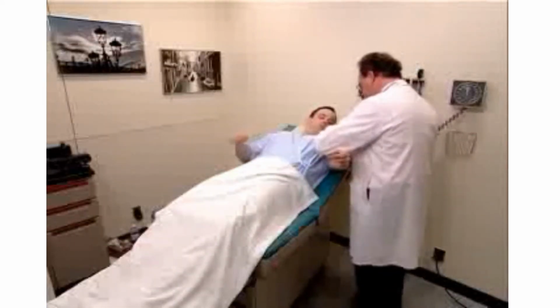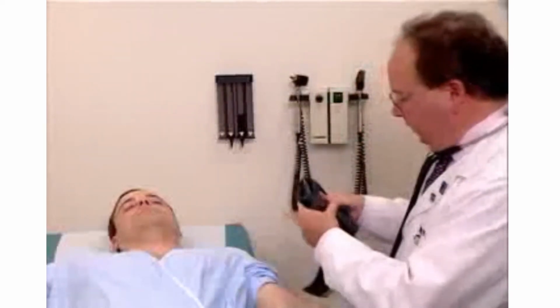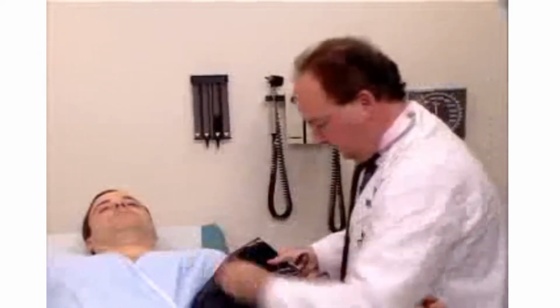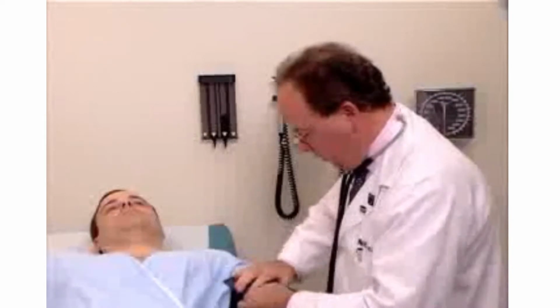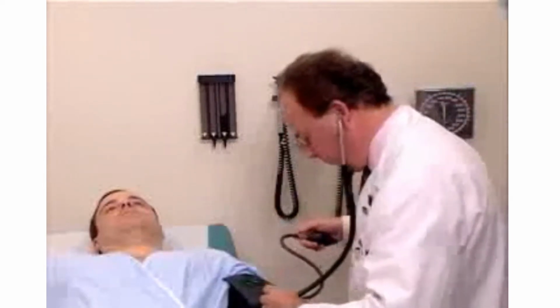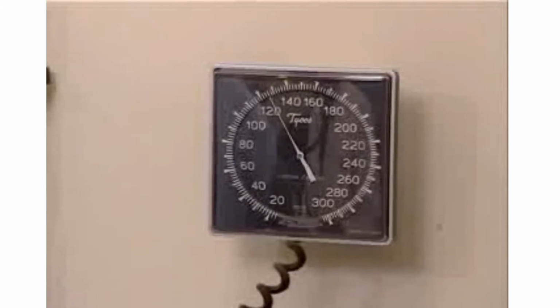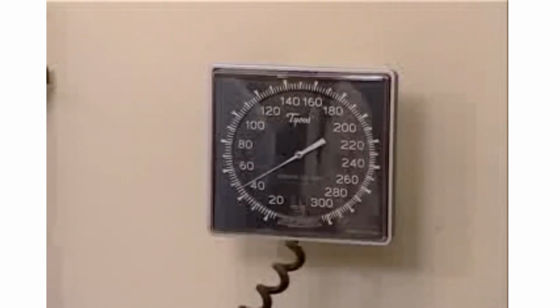Mr. Johnson, may I just lift this up? Remember that the brachial artery is medial in the antecubital fossa, and the blood pressure cuff is applied just as we did for the right arm. Placing the stethoscope over the artery medial in the antecubital fossa, we will now proceed with blood pressure by auscultation. We will pump up the blood pressure cuff to about 20 millimeters higher than systolic and deflate the cuff slowly to record systolic blood pressure and diastolic blood pressure.